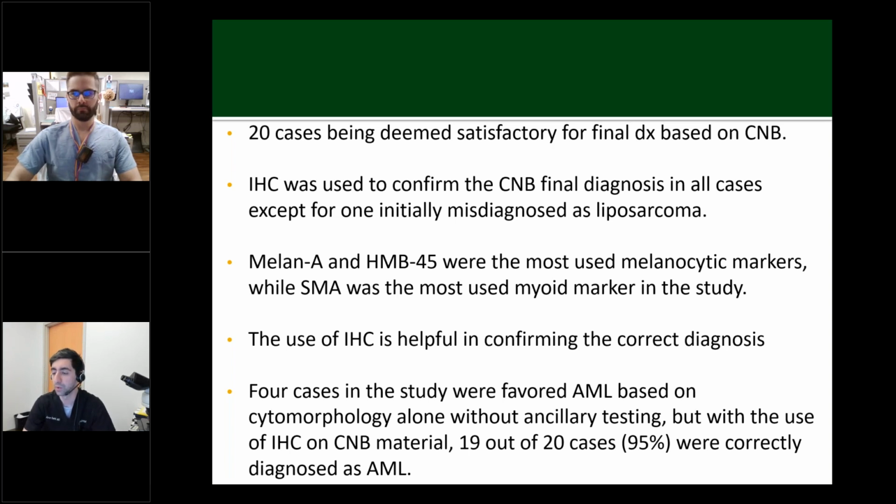Four cases in the study were favored angiomyolipoma based on cytomorphology alone without ancillary studies, but with the use of IHC on core needle biopsy material, 19 out of 20 cases were correctly diagnosed as angiomyolipoma.